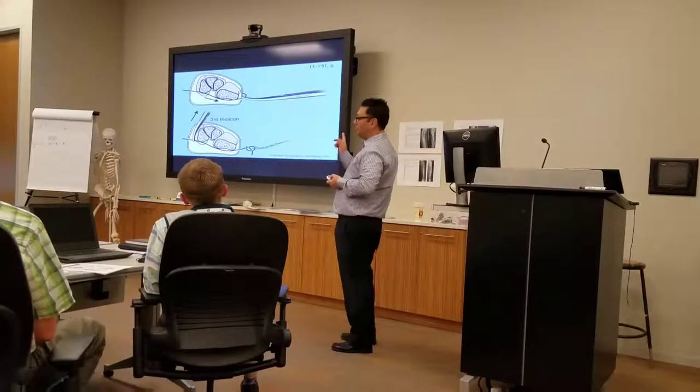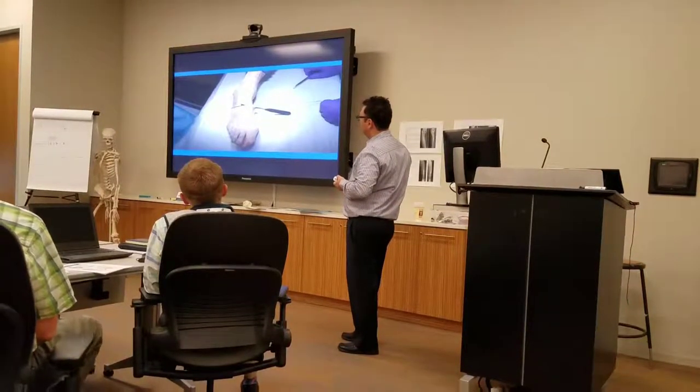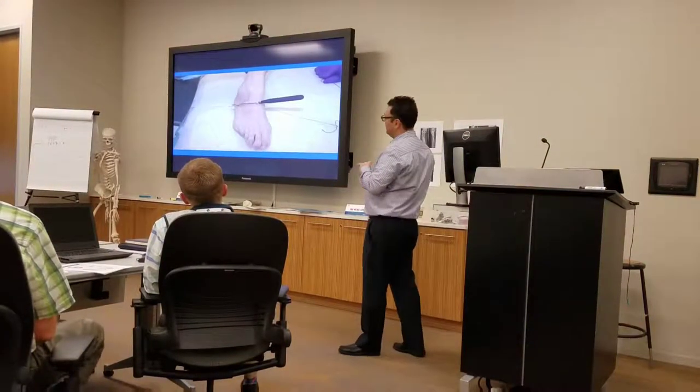You could do this both ways. You don't have to do medial; you could do lateral to medial as well. So here's your going up. I actually prefer to do this method.